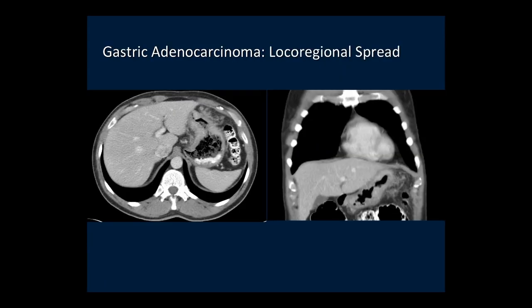Once we identify the tumor on CT, the goal is to stage it. Gastric carcinoma infiltrates and spreads directly into adjacent structures, including the lesser and greater omentum. We can see tumor extension by linear strands and nodules into the greater omentum on both axial and coronal images.